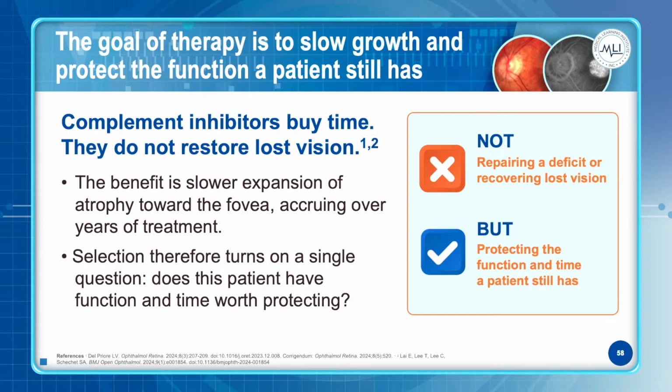There's a lot of discussion in the community about how we did not see function prospectively in clinical trials. We saw a hint of it in the third year in the pegcetacoplan study, but at that time, when these studies were launched, I had no gray hair and no wrinkles, and our imaging tools were not very specific. I remember we were part of both the DERBY and OAKS studies, and one of the studies had microperimetry, and with patients with central GA lesions, it was very difficult to even get a test.